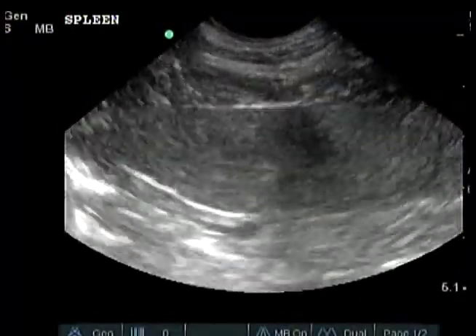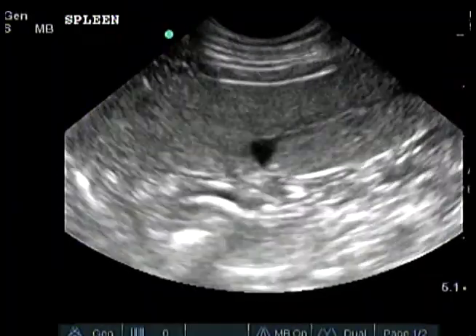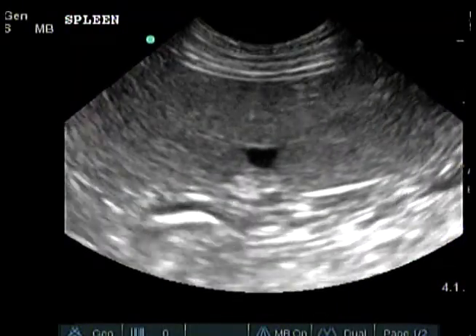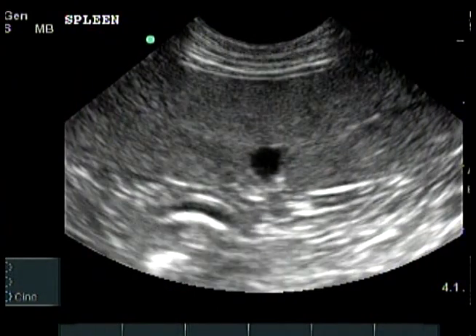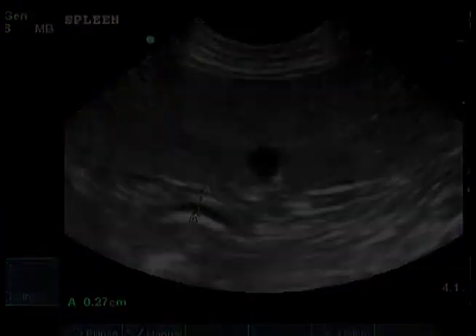The red pulp of the spleen phagocytizes old red blood cells and helps metabolize hemoglobin. The white splenic pulp contains nodules with functions similar to lymph nodes. On ultrasound, the red and white splenic pulp appear as homogeneous, finely textured splenic parenchyma, slightly more echogenic than liver.